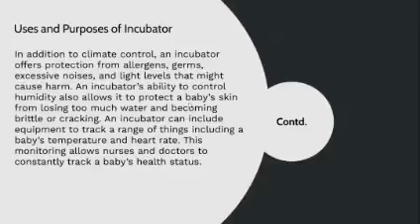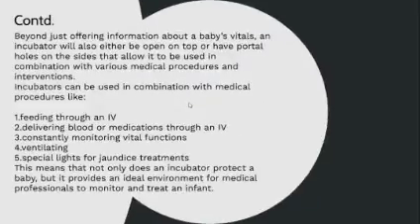An incubator also includes equipment to track a range of things, for example, baby temperature and heart rate. This monitoring allows and facilitates nurses and doctors to take care of our baby. Along with offering information about the baby's vitals, an incubator can either be open on top or have portal holes on the side. There are three types of incubators.